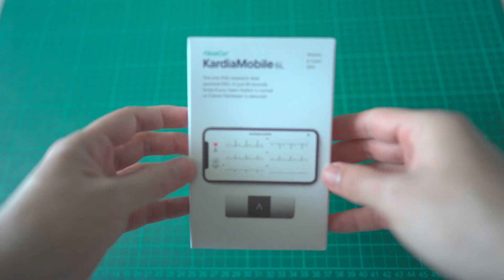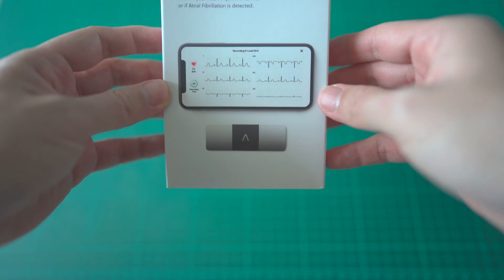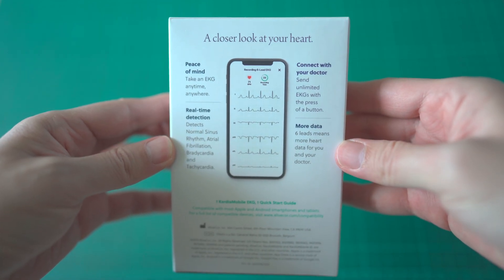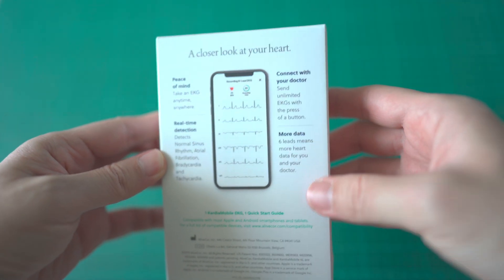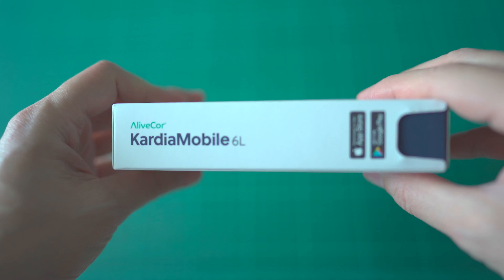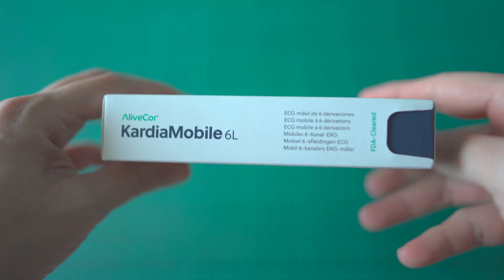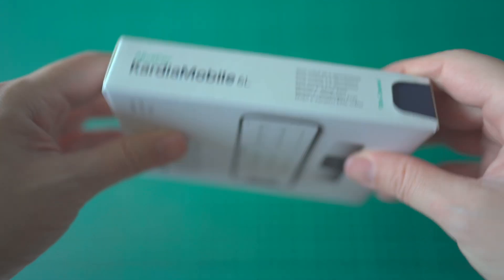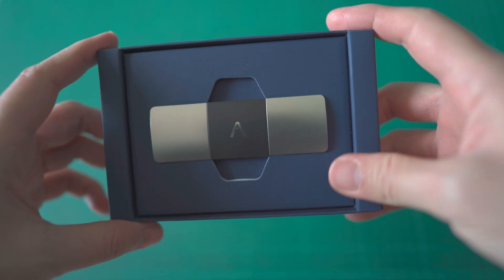Let's take a look at the product packaging. Kardia Mobile 6L is an FDA cleared medical grade 6-lead personal EKG that fits inside your pocket, so that you can take an EKG anytime, anywhere. The device is capable of real-time detection of normal sinus rhythm, atrial fibrillation, bradycardia, and tachycardia. ECG recordings can also be exported into password-protected PDF files so that you can share with your healthcare provider. Given this is a 6-lead EKG, that means more data for your doctor. The device runs on a 3-volt CR2016 lithium battery and can be paired with phones running iOS and Android.